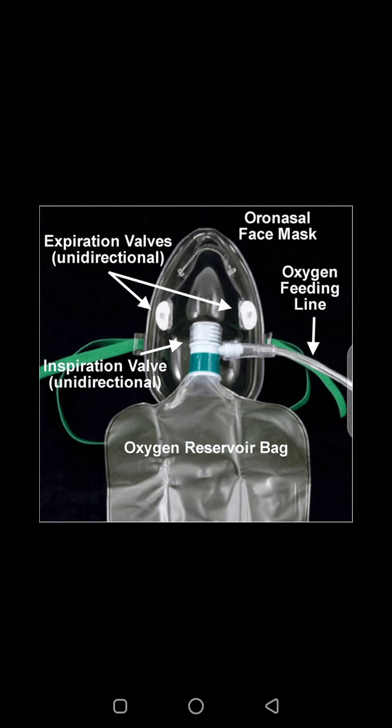It must be filled up with oxygen because it is from this reservoir bag that the patient takes in oxygen when the patient inhales. And the inspiratory valve, just like I was explaining, opens up when the patient inhales so that the patient will take in enough oxygen from the reservoir bag. Now the expiratory valves close up when the patient inhales air.